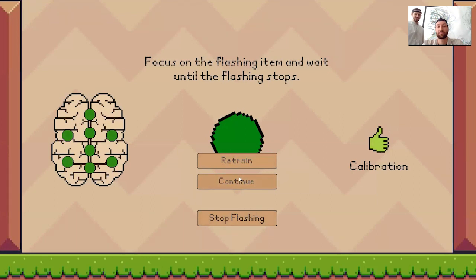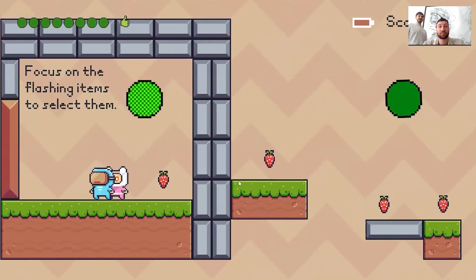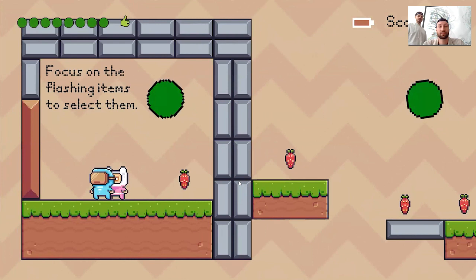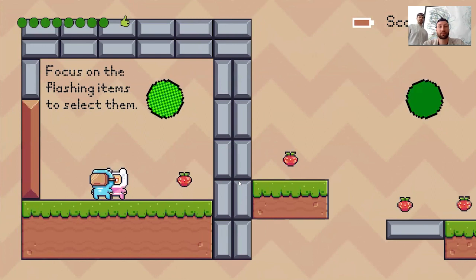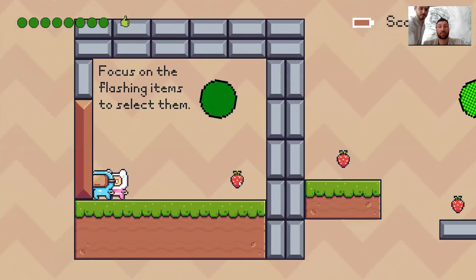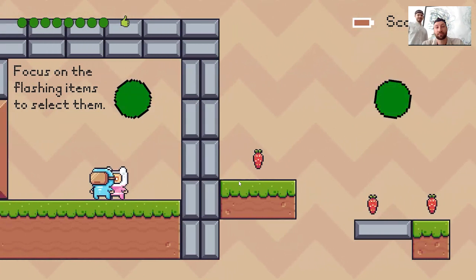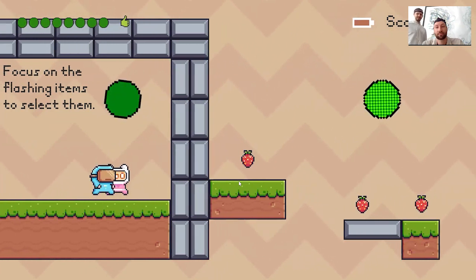Yeah, now we got a good classifier. So right now, Leo has to look at the green dot. So relax, focus for a couple of seconds. And not working at the moment. So Leo is not able to focus well. Maybe we'll focus on the second dot.